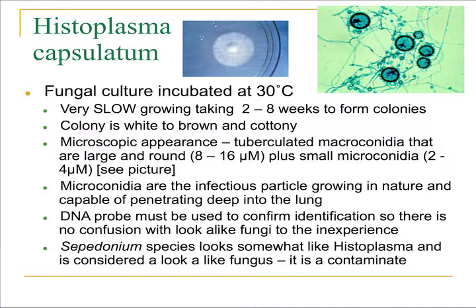Even though this colony, when you do a Scotch tape prep and look at it under the microscope, has very characteristic macroconidia, there are still a few organisms that could potentially be confused with Histoplasma. And when you're diagnosing someone with a dimorphic fungal infection that could take weeks and months of therapy, you want to make sure you're accurate.